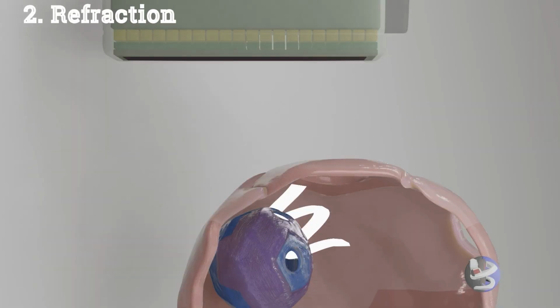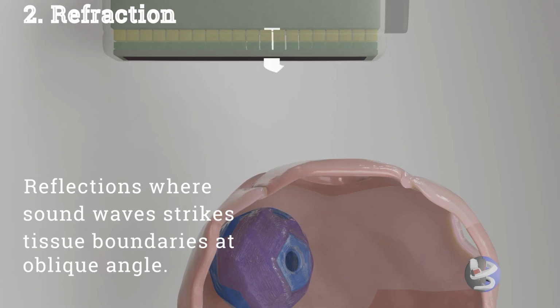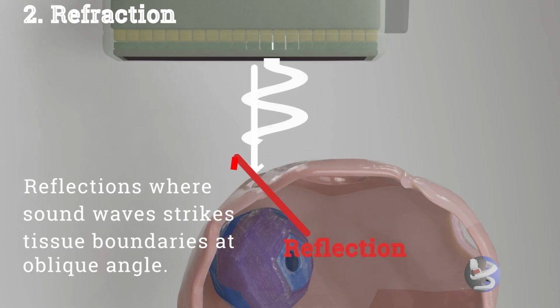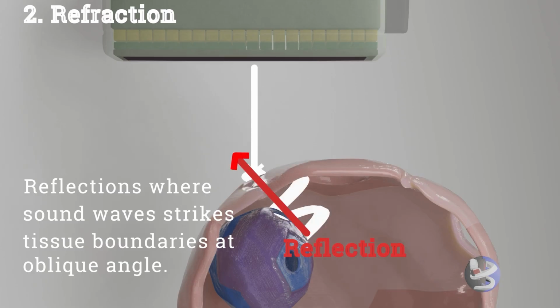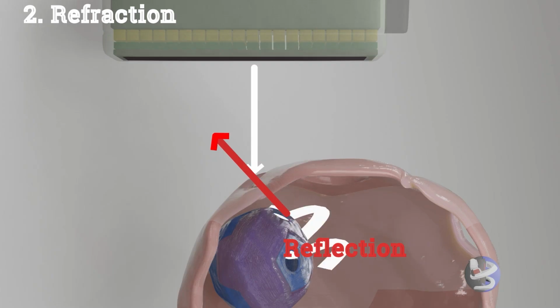Refraction and scattering. Refraction is reflection where sound strikes the boundary of two tissues at an oblique angle. The reflections generated do not return directly back to the transducer. Refraction occurs when the ultrasound signal is deflected from a straight path and the angle of deflection is away from the transducer. Refraction only occurs at a different medium interface of different acoustic impedance.